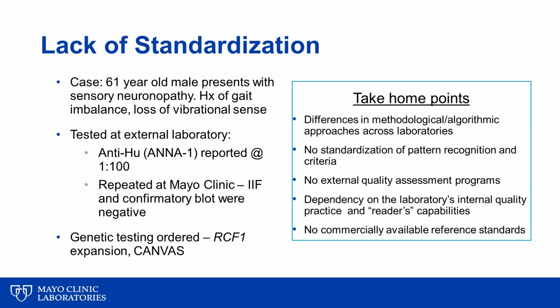An important take-home message is that there are significant differences across laboratories in terms of the methodologies that are utilized, how those methods are organized into testing algorithms, and the quality of interpretation of tissue immunofluorescence and cell-based assays. This is further exacerbated by the lack of external quality assessment programs within the United States, the lack of assay standardization, and the lack of availability of reference material.